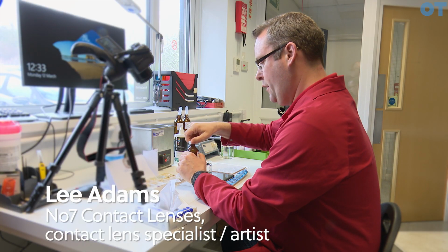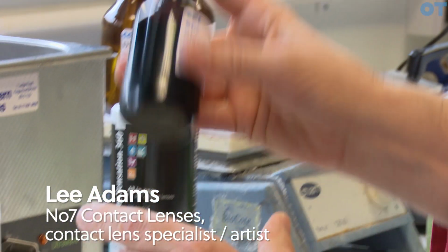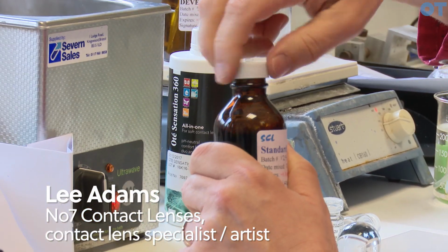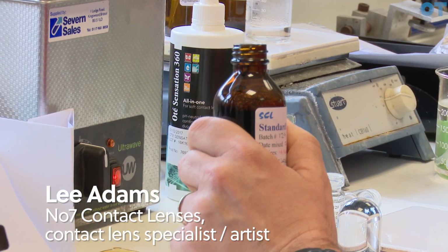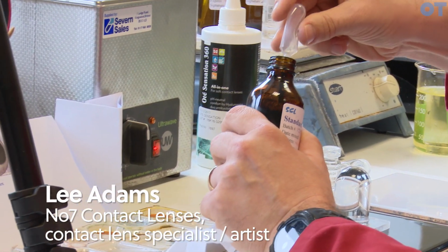So I'm just going to start putting the dyes into the palette now. These are water-based dyes. So normally I dilute some of the dyes, I don't just use them as they are in the palette. Once you go too dark with these, you can't then turn it around and go lighter, because I don't have a white, so I can't cover up anything that goes wrong.